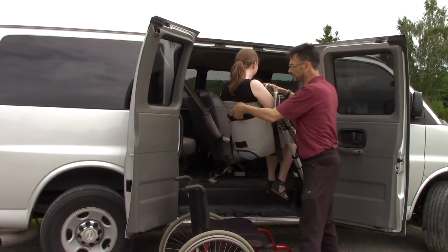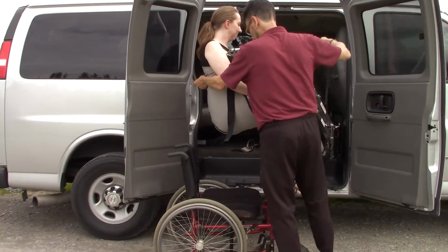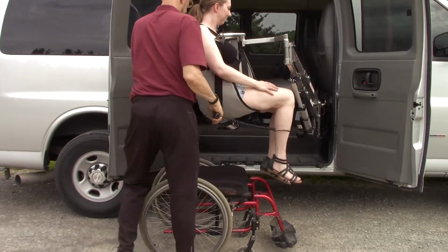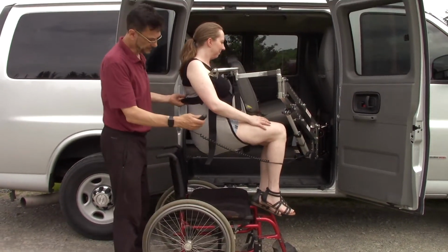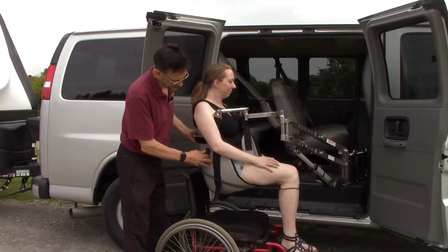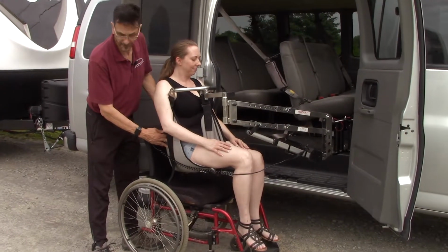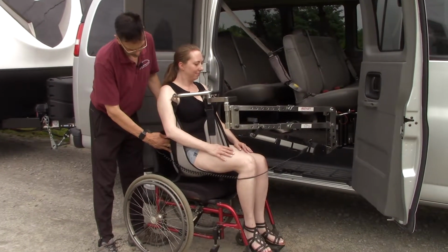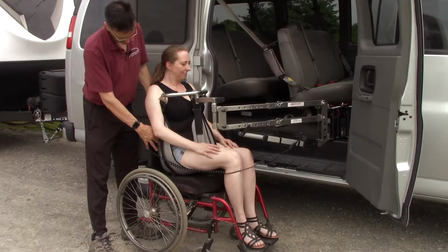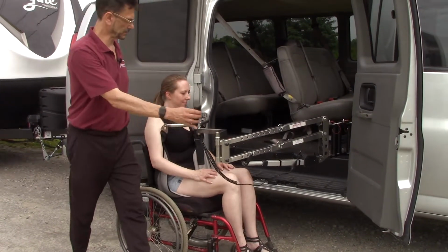Once the feet have cleared, we move to position over the wheelchair. Move around to the back so we can get nice control over the descent. Lower right straight down into the wheelchair with a nice erect and vertical posture. A little bit of upward pressure on this back handle here is really helpful.